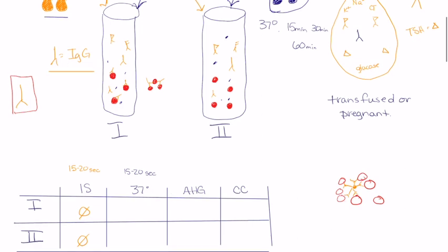And once again, I'm going to throw this out there and warn you. Most of the time, if it's an IgG antibody, you're not going to see a reaction at 37 degrees. Again, they're just not strong enough. They can't form that lattice over here like our IgM does to see that reaction. But the antibodies sensitized those cells, but we can't see it. So how are we going to see it? What do we do next?